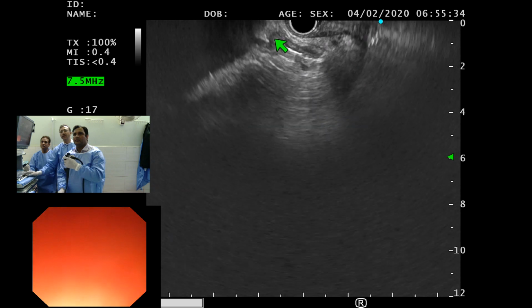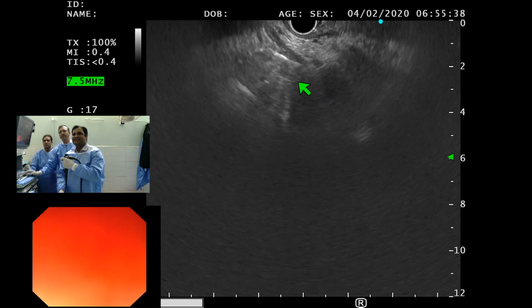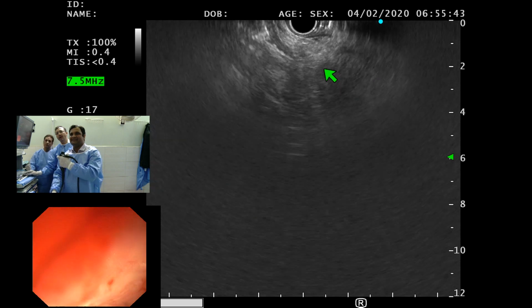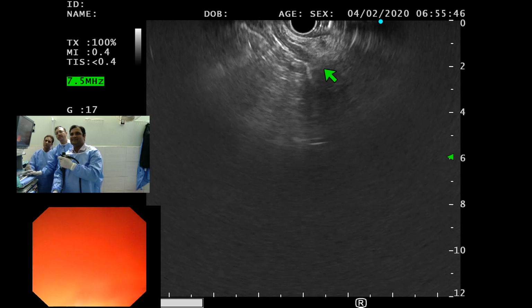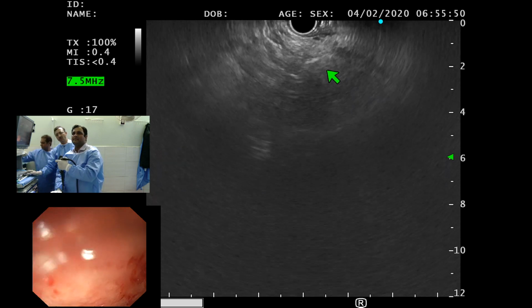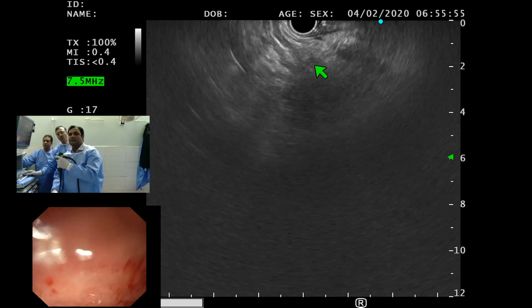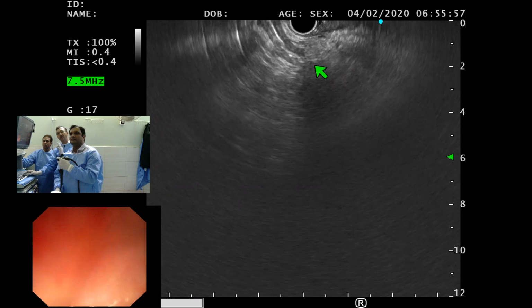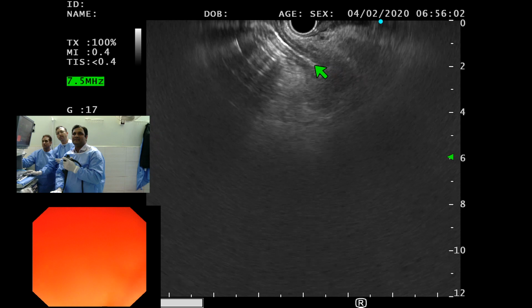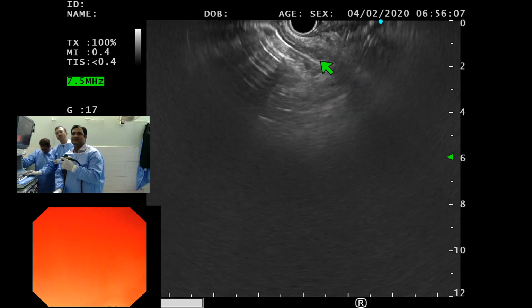This is the common bile duct. You can see the linear lines inside the CBD. Just follow it down to the head region. Go clockwise. Go slow, with a slight subtle turn, and keep the suction on. Big wheel up, big wheel away from you. Try to follow it.